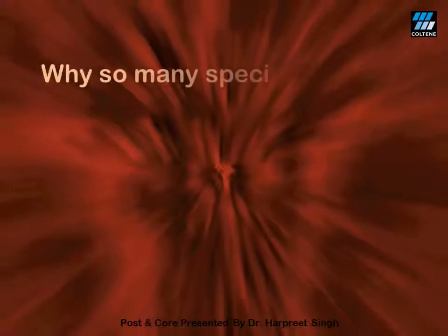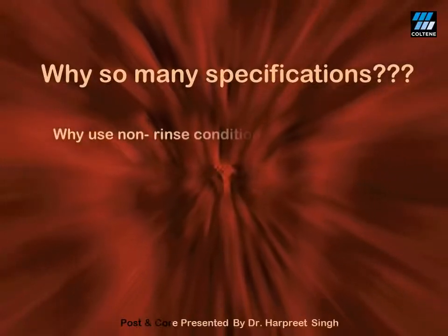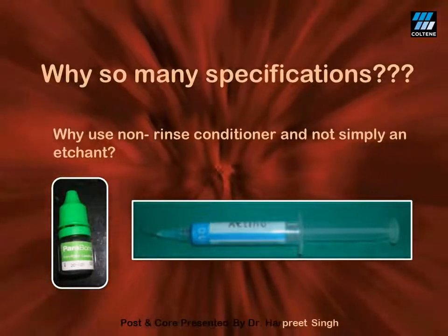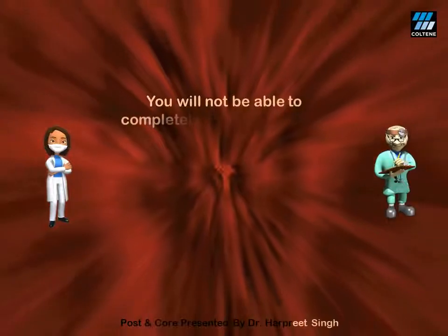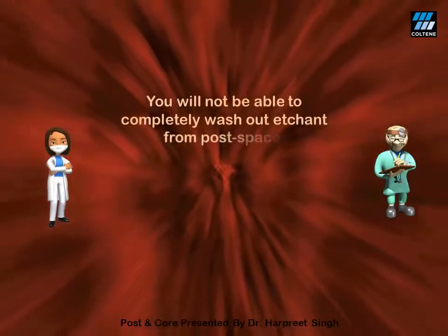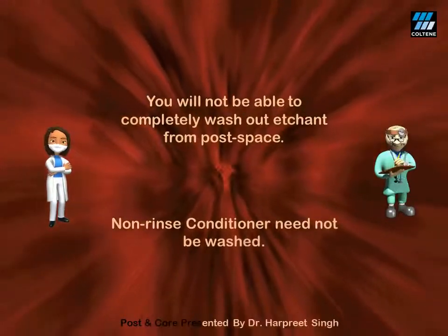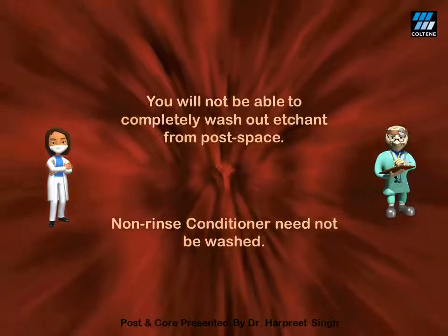Many practitioners often ask me, Dr. Harpreet, why do you insist on so many specifications in the luting protocol? For instance, why use a non-rinse conditioner for conditioning of dentine in the post space? Why not simply use an acid etchant? The answer is pretty simple. First, the etchant is very strong and must be used only for enamel — we always condition the dentine and never etch it. Second, it will be very difficult to completely wash out the entire etchant from the post space. Conditioners, on the other hand, need not be washed off; just the extra conditioner is dried using paper points.